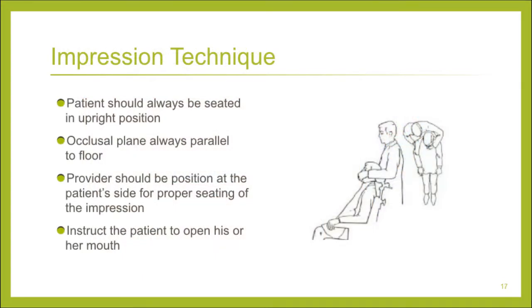Impression techniques. I talked about them a little bit as we were taking the impressions. This is really important: make sure of the positioning of where you are. My chair is all the way to the ground always, because I want to be higher than the patient. So when I seat the impression, I can come around them with their face towards you, and I can really see up and over where the handle is.